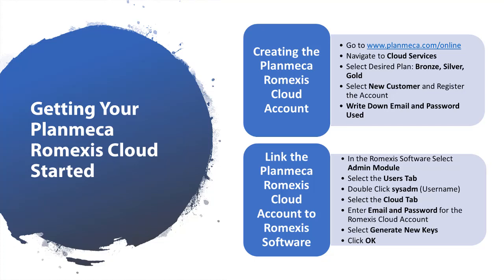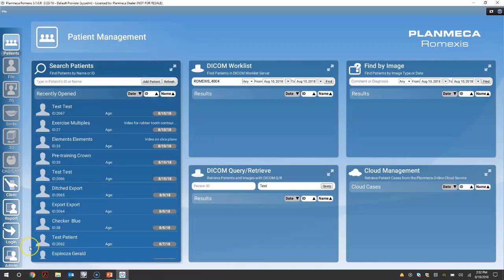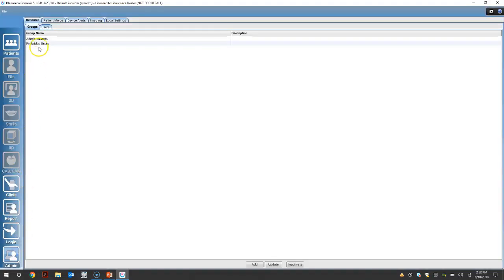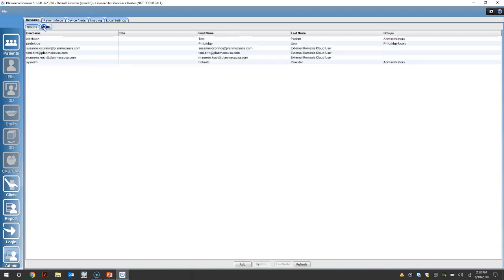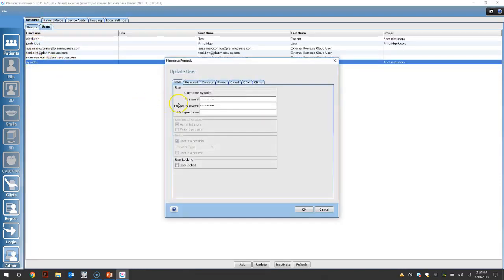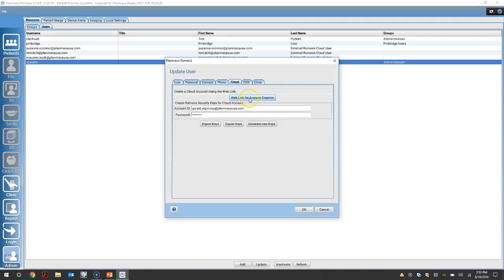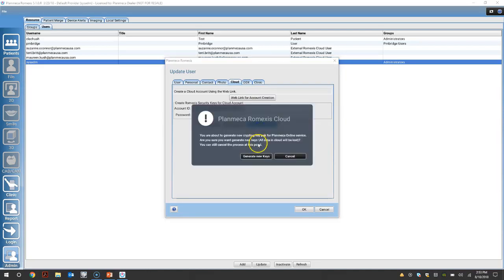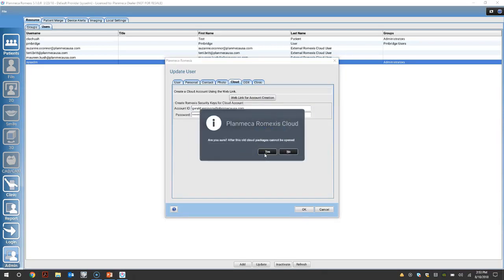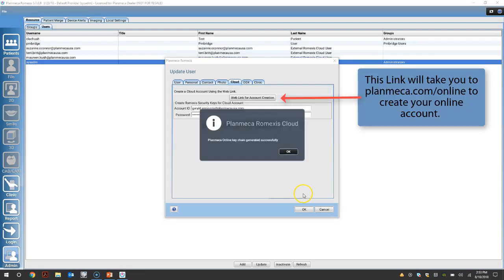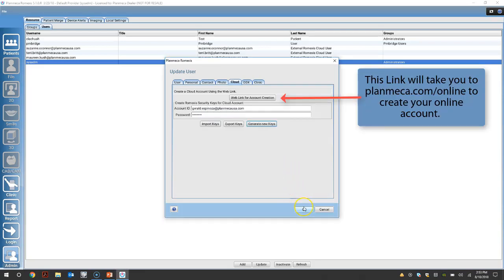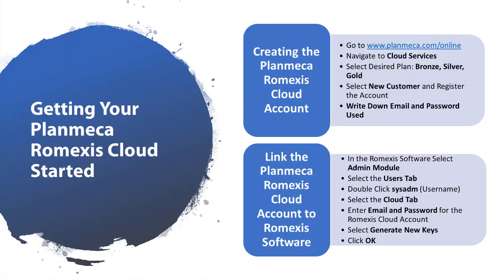I will show you how to link the Planmeca Romexis Cloud account to the Romexis software. I already created my account, so let's link the software. Go to the admin module. Select the resource tab. Select the user tab. Select the SYSADM and select cloud. Here's where you'll enter your email and password. Select generate new keys and just continue to click through the pop-ups. The link above will take you directly to create your account. Here you'll see the written instructions how to create your Romexis Cloud account and link in the software.